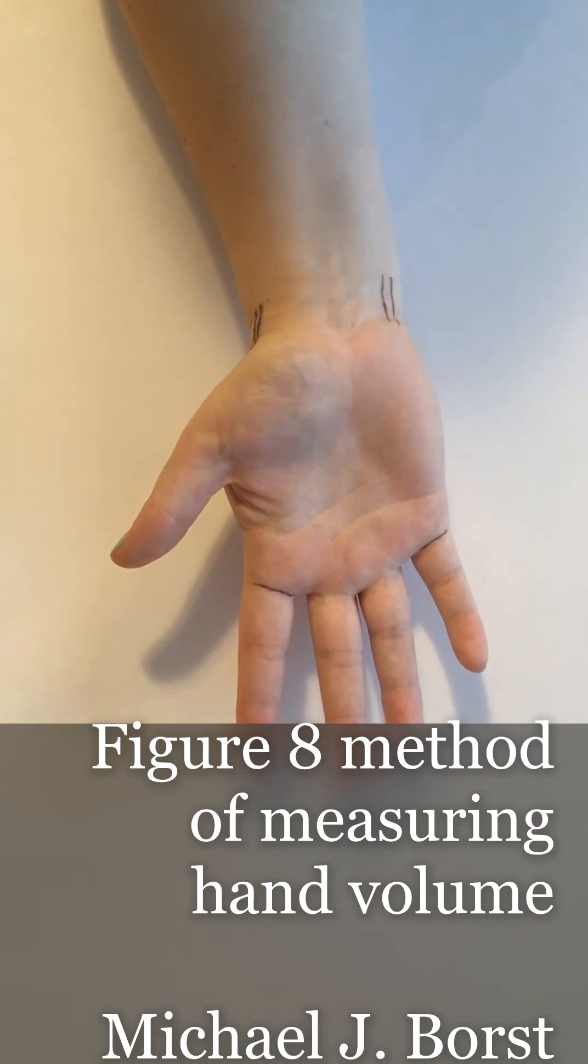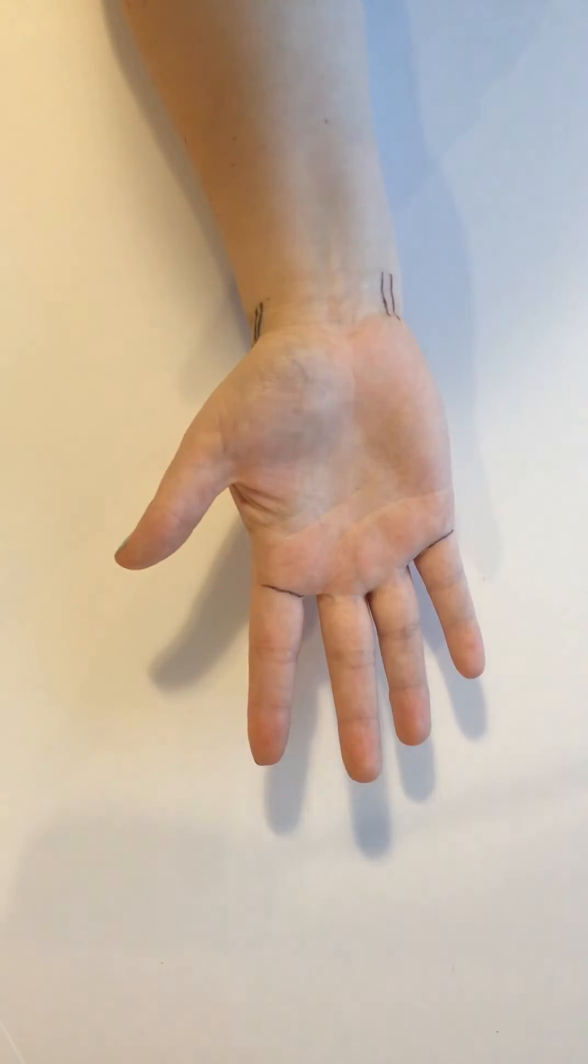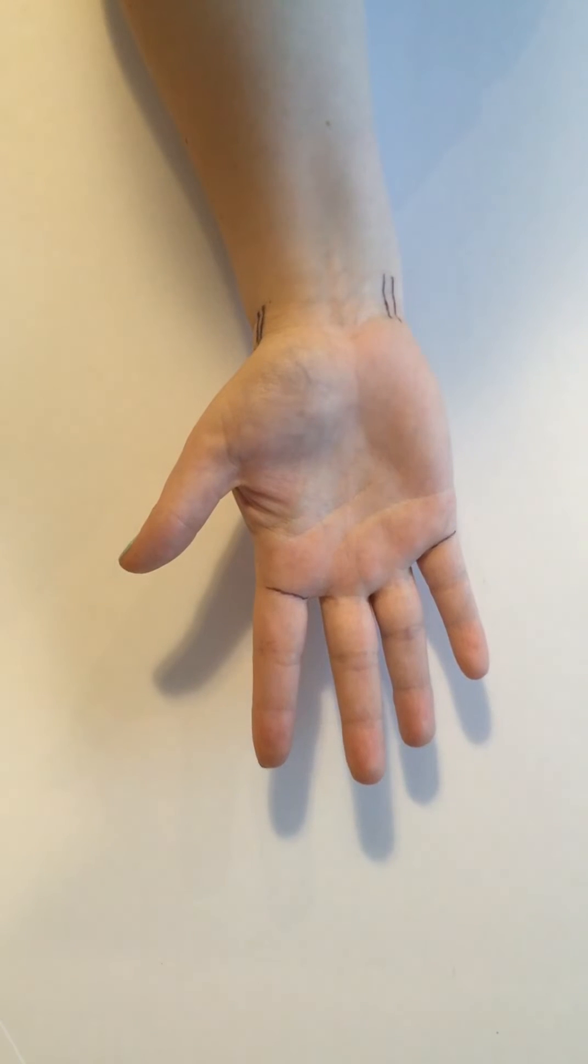In this video we're going to demonstrate the figure-eight method of measuring hand volume as originally described by Mayheffer and others in 2003 and subsequently adopted by the American Society of Hand Therapists as the official way of doing this.